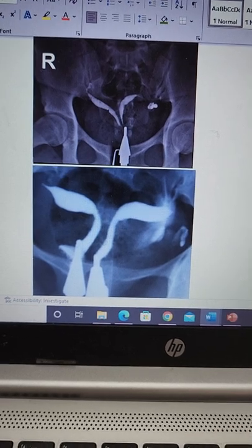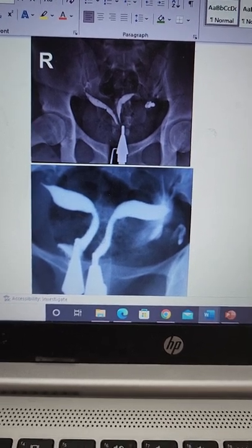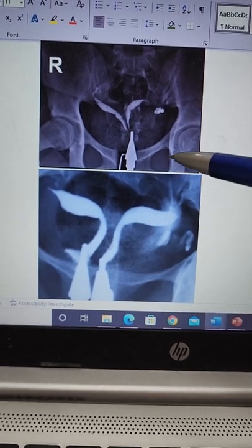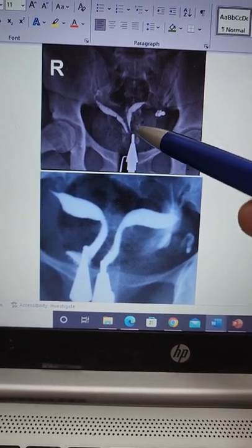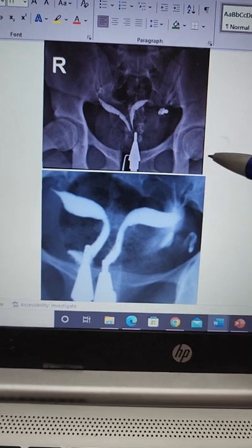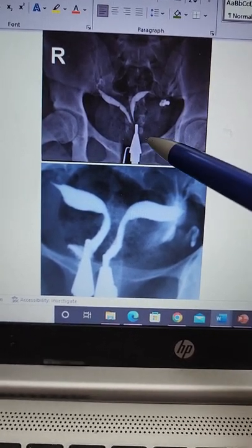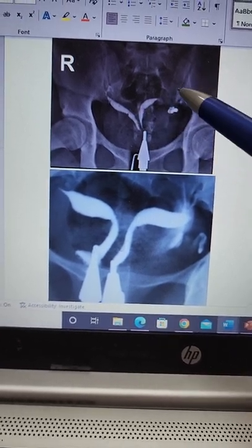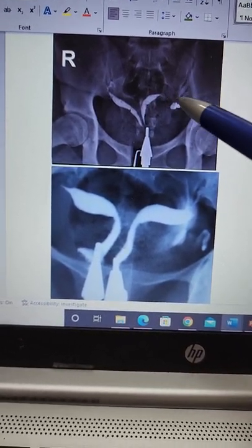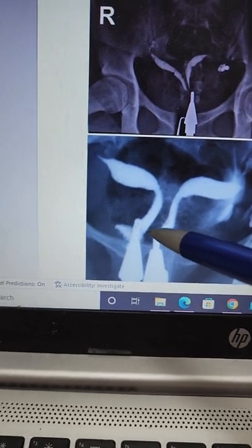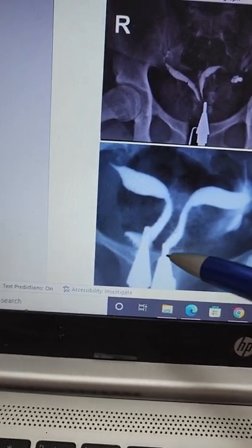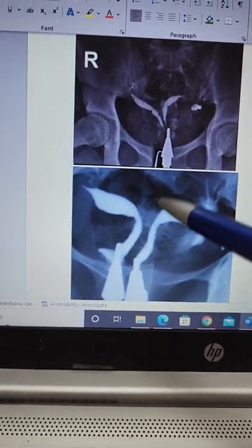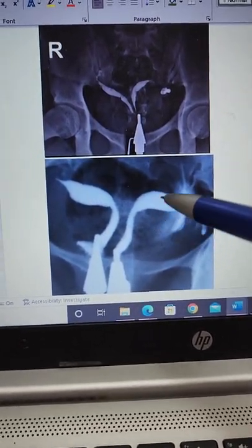Let's start with the easiest one — uterine didelphys. As you can see in both these diagrams, a uterine didelphys shows horns that are completely separate with no communication at all between them. In the first picture, one leech wilkinson cannula is going in and filling both cavities separately with no communication. In the second, which is a more classical picture, two leech wilkinson cannulas enter both cervixes separately and fill the horns.